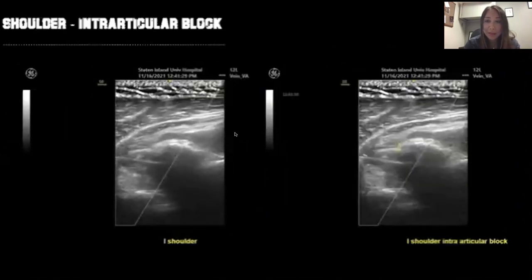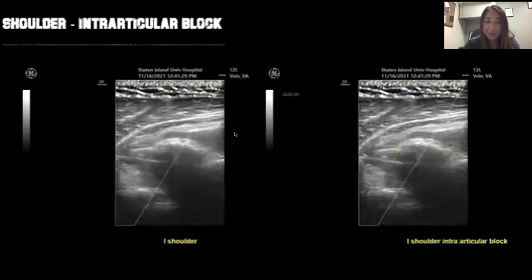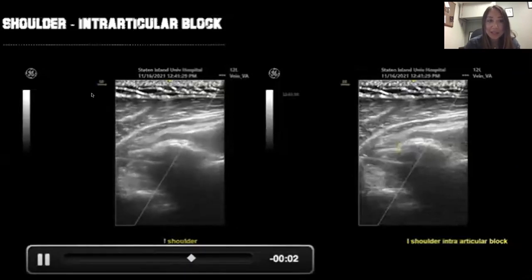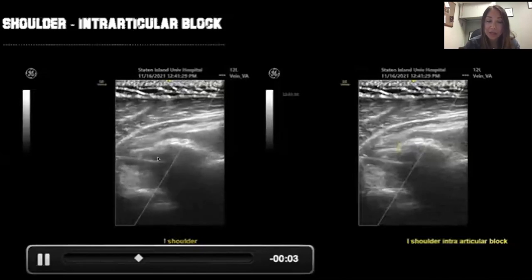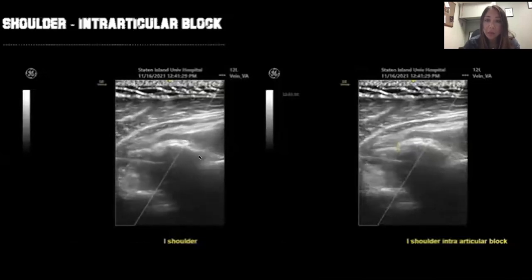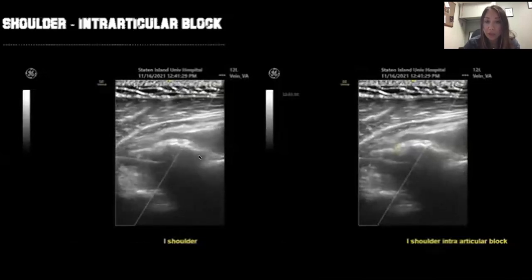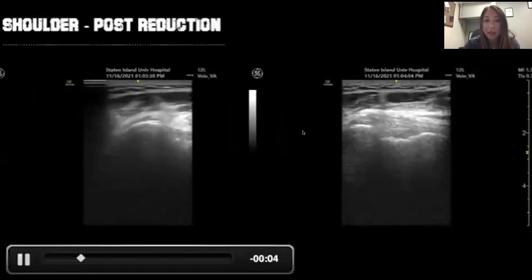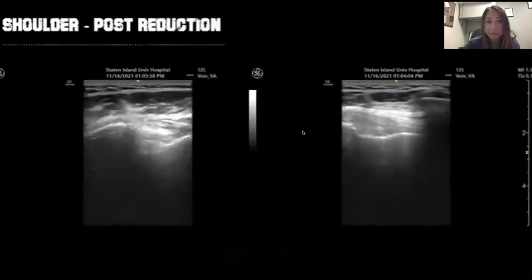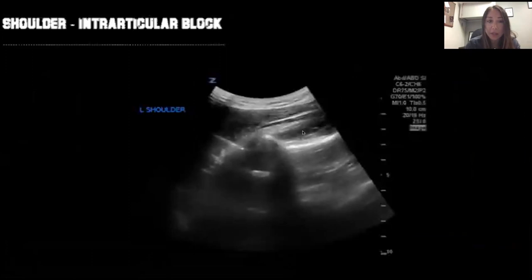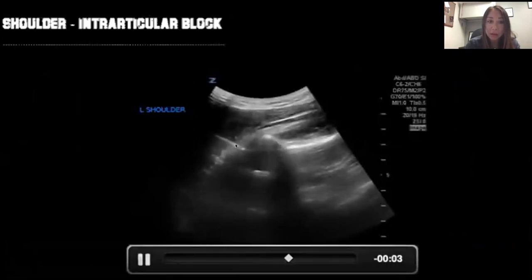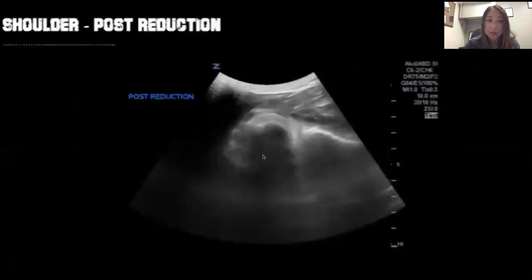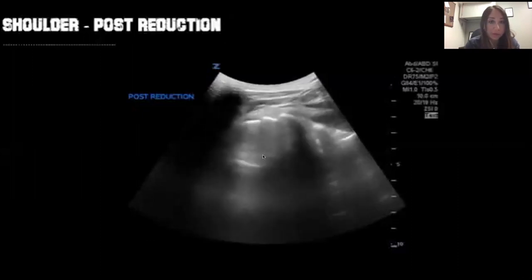As the theme goes — we see it, we diagnose it, we treat it. Here we did an intraarticular block, going right into the area of dislocation to anesthetize it. Then we performed the shoulder reduction and quickly did a post reduction scan — now you can see everything is perfectly aligned. In another intraarticular block example you can see the needle going in right above the humeral head, and the post reduction ultrasound confirms everything is now perfectly aligned.